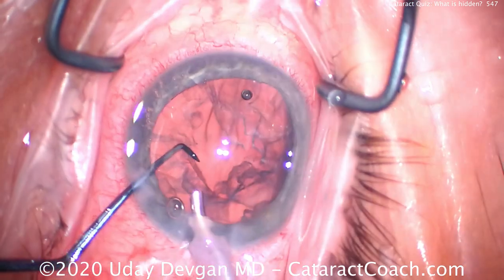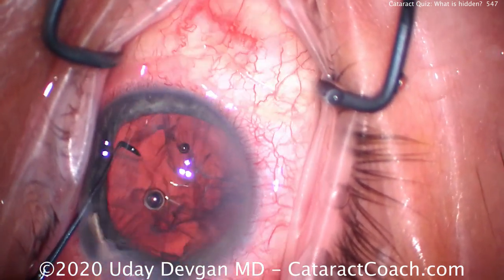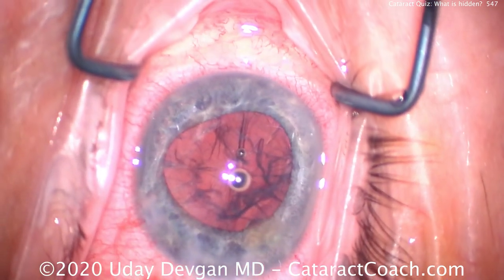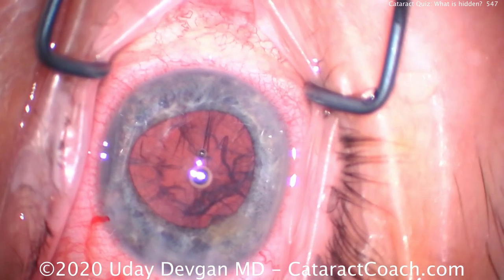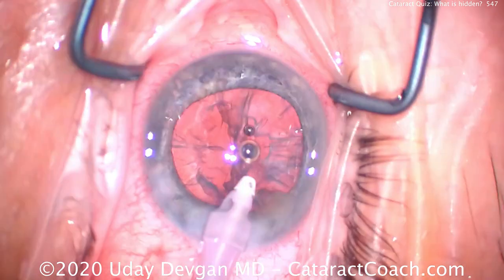Did you see that? One piece got pushed into that angle — it's subtle. If you don't watch so carefully you don't even realize it. And with a patient with a blue iris like this, that cataract nuclear piece kind of hides. It's still hiding there right now — there it is, to the right of the main incision.